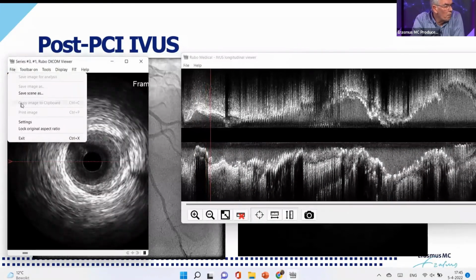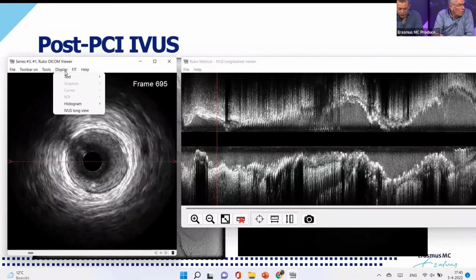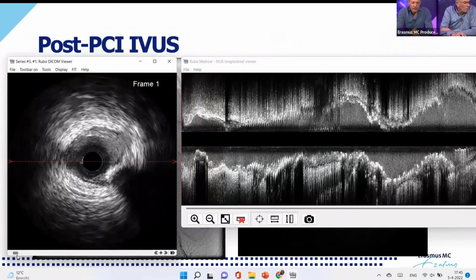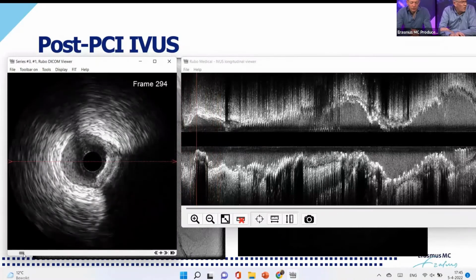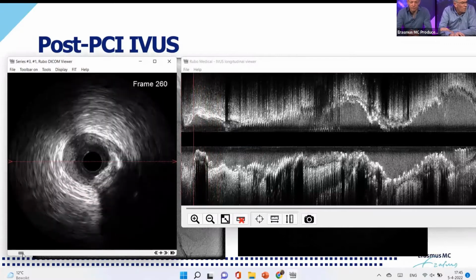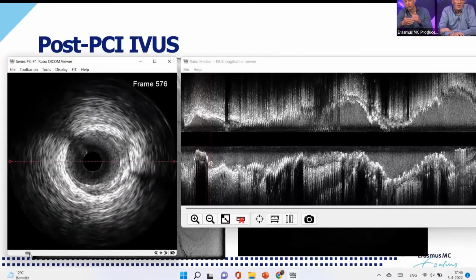It's actually a good question with respect to HD IVUS in general. So we were used to 20 megahertz technologies. Then we got the opportunity to use 40 megahertz technology, which mainly improved the near field resolution. But with that, we paid a little bit of a price in penetration depth. And now with the 60 megahertz catheters, we even further increased our near field resolution, but paid a little bit more in terms of penetration depth.